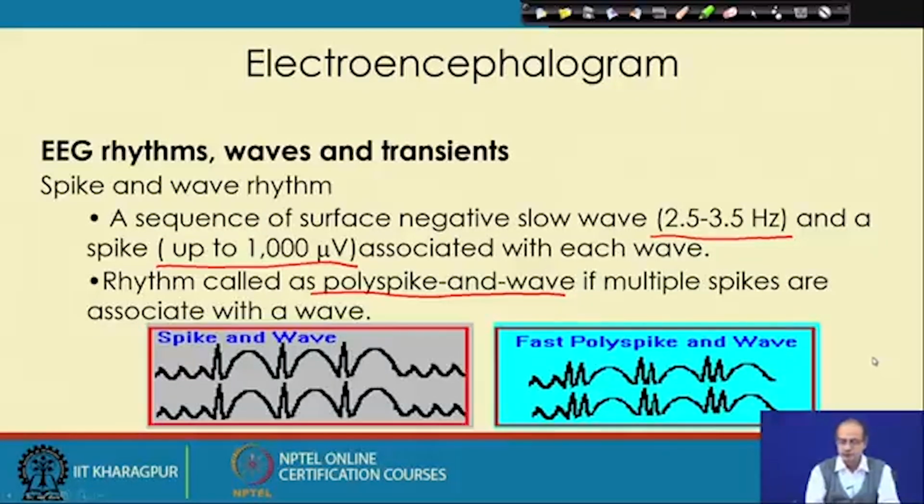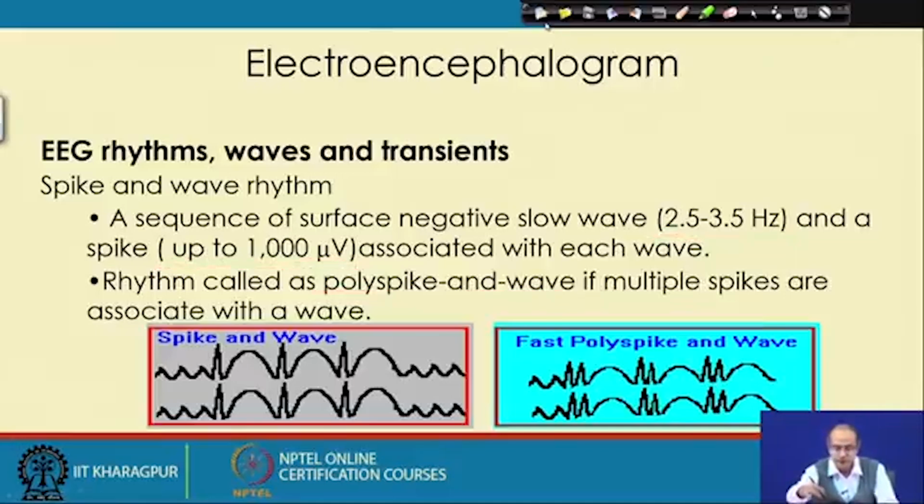The spike is predominant because of its amplitude, and we cannot miss the following low frequency wave also, because it has some shape. That is why it got a separate existence, unlike the delta or theta wave. So, that makes it different from those predominant waves.